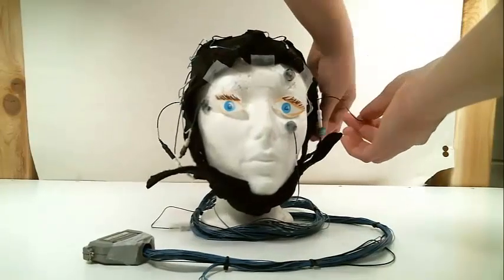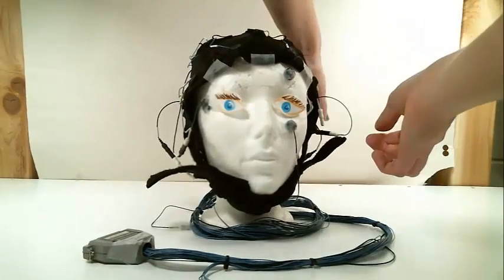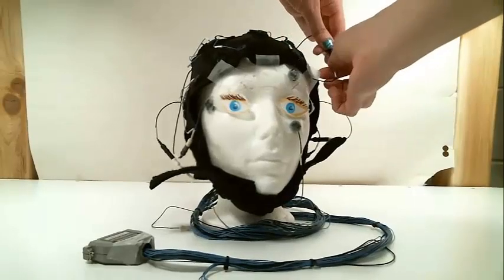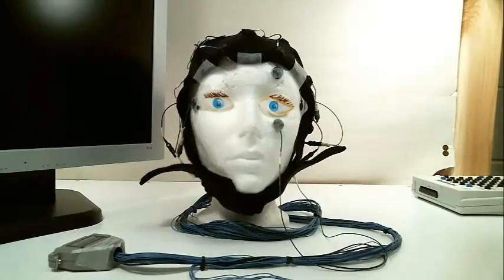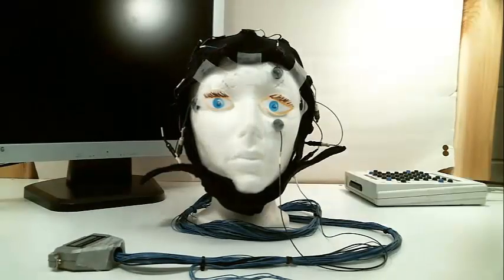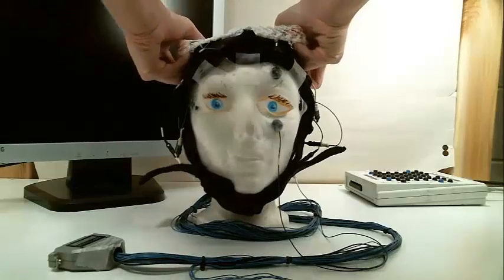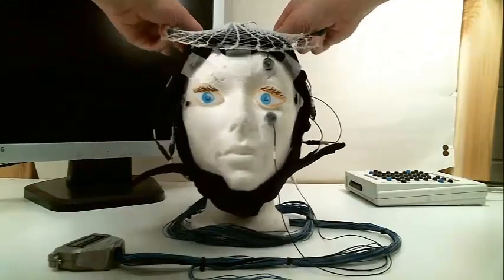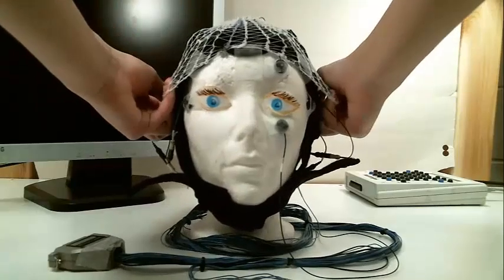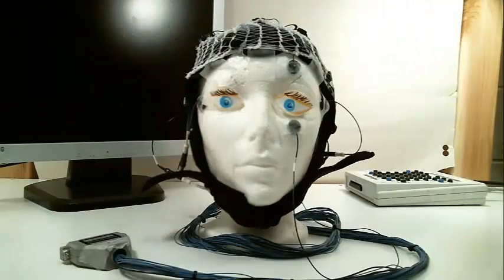Hook up the face electrodes to the cap. The left mastoid connects to A1 and the right mastoid to A2. If the cap is too loose and you can't go down a size, a piece of mesh can be applied on top of the cap in order to flatten the electrodes to the head. Again, this is specific to our procedure, not necessarily a standard step.